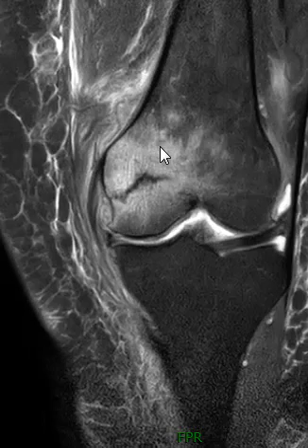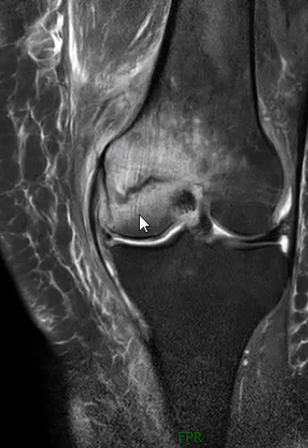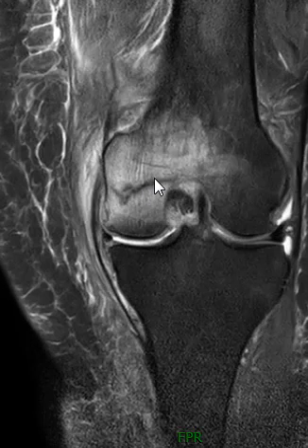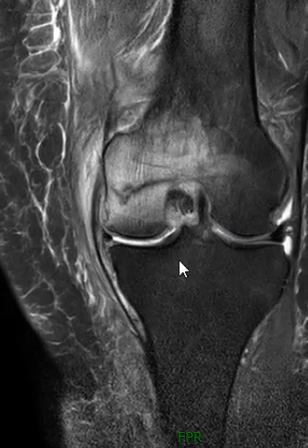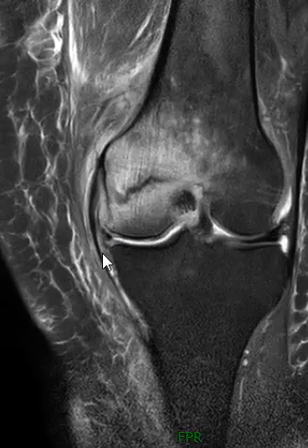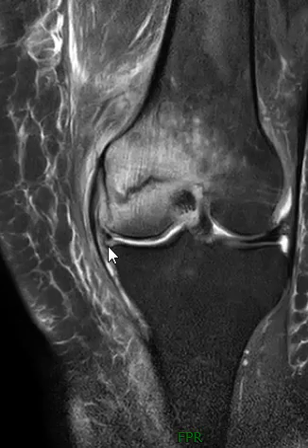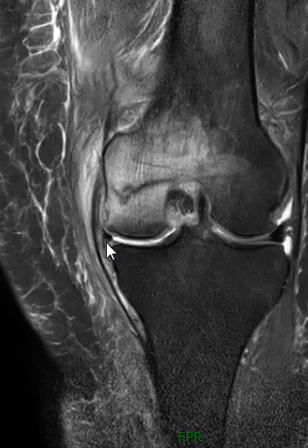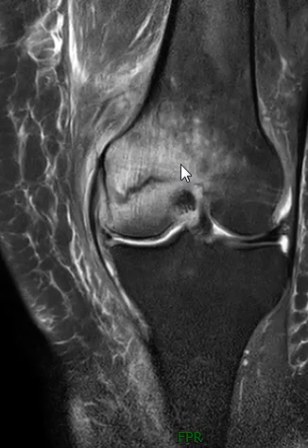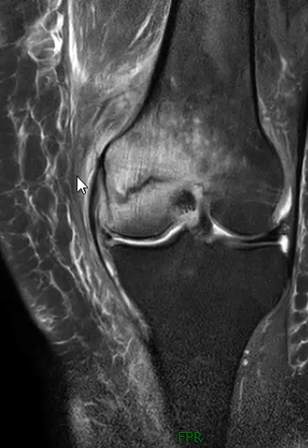If they don't stop weight-bearing and take it very easy, this could go on to collapse, and when this collapses, that can be a very difficult thing to treat. And the meniscus, instead of being a nice black triangle like before, it's irregular and torn, so there's a complex tear. Without much of this medial meniscus, it's a lot worse than before, and again this bone marrow edema has moved over here.